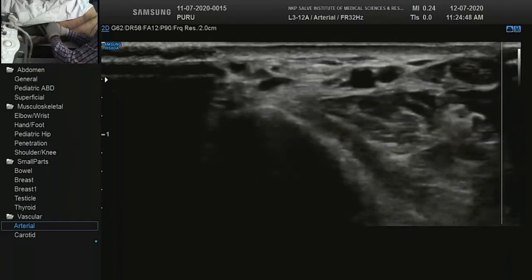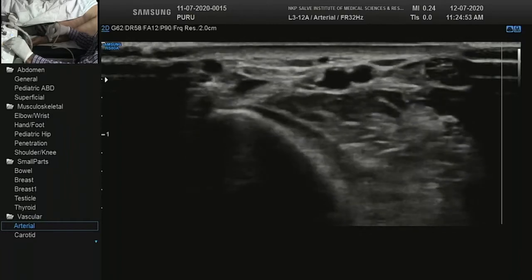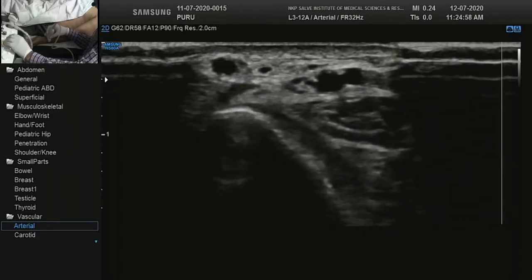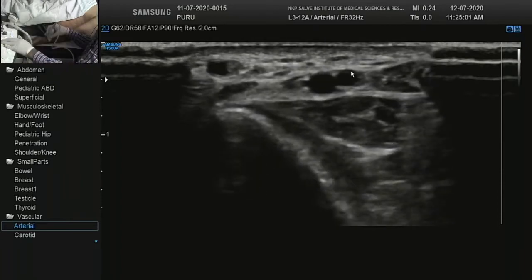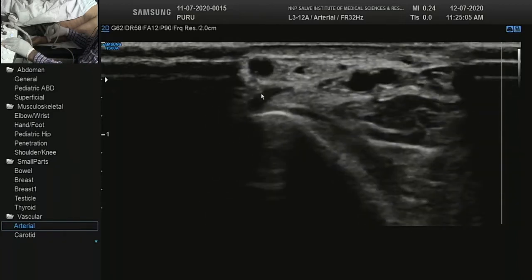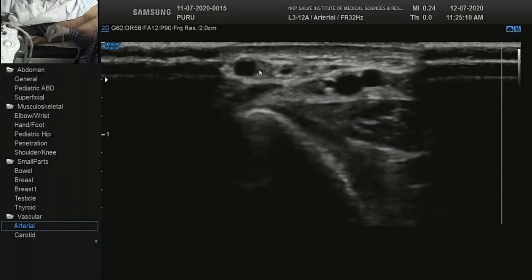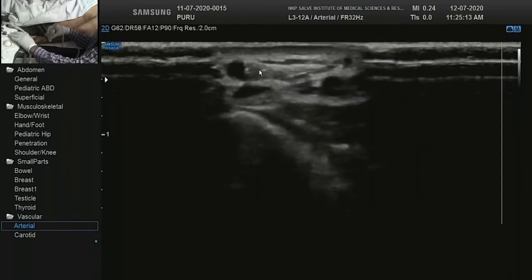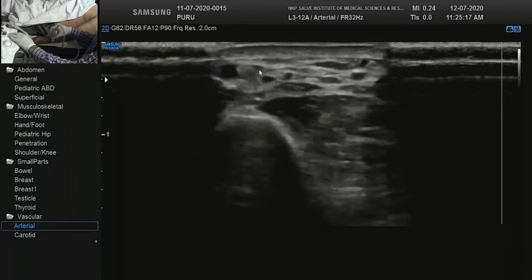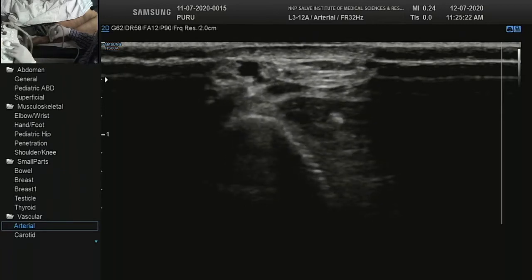So for dialysis, AV fistula is commonly created between the radial artery and the cephalic vein. So identification of the cephalic vein is very easy. You see the radial artery in transverse, that is the radial artery, that is a radial concomitant vein, and this is the cephalic vein. If you see it like this in a transverse section, it is lateral and very superficial. So what we need to see, as I said in the presentation, is the cephalic vein. We need to see its diameter.